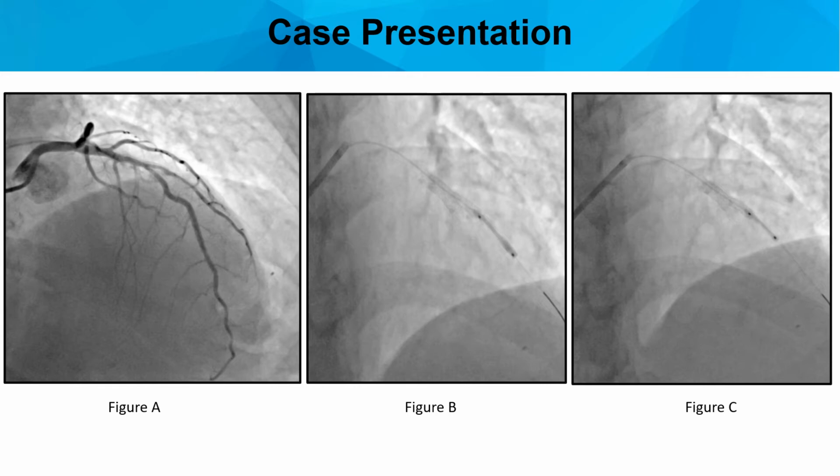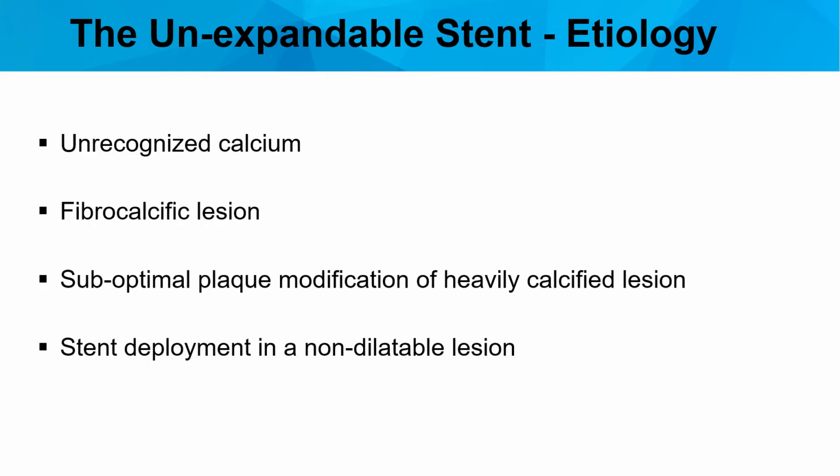So, what would you do next? Would you place a stent? Would you perform further modification of the lesion? Or would you give up? So that brings us to our talk on the unexpandable stent.